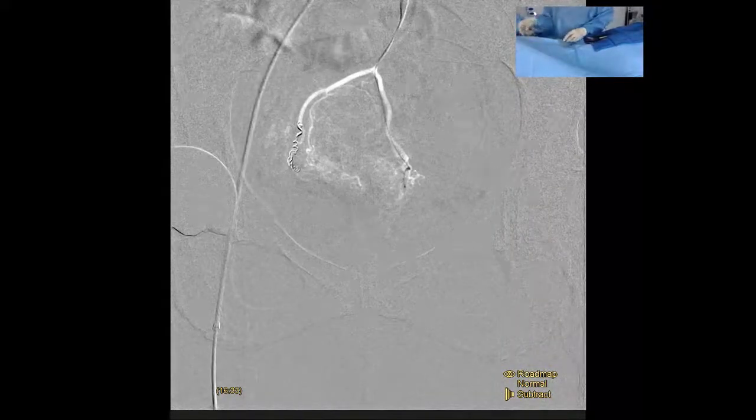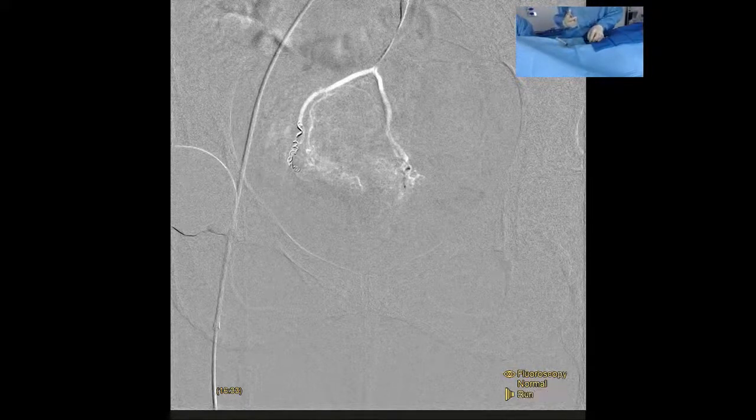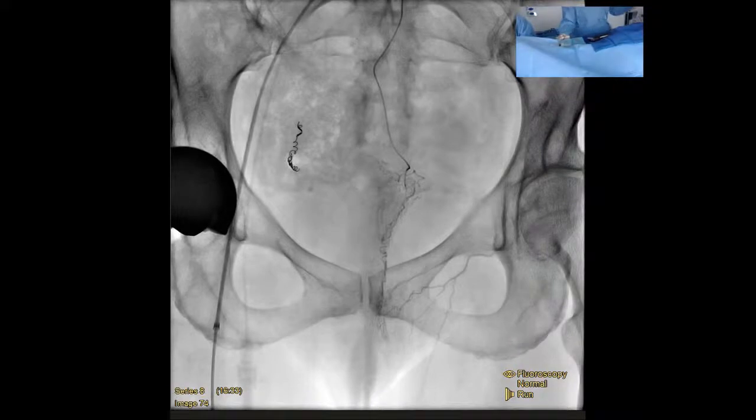That's how easily we got distally there. Now, what about coiling? When you coil, is it standard to usually use 2 coils in a vessel? Typically, I'll use 2. As you know, patients of the interventional radiologist, if we waited a minute, we probably would have gotten some. But it's impossible for us to wait because that's the nature of our specialty.